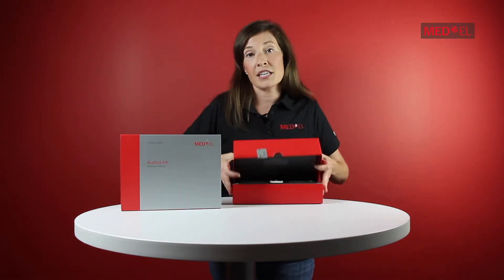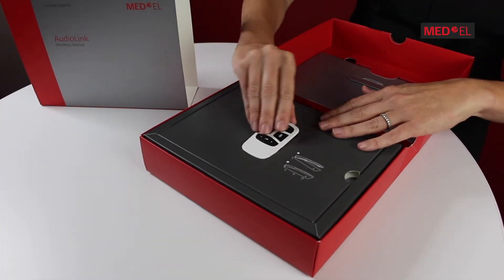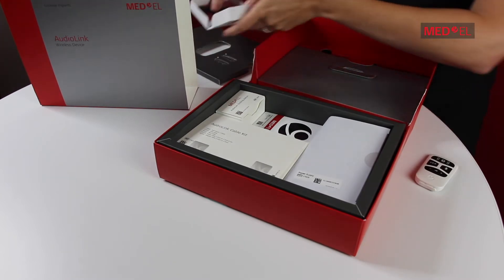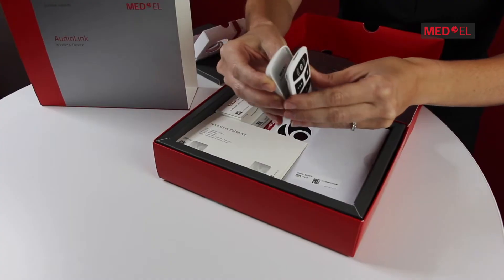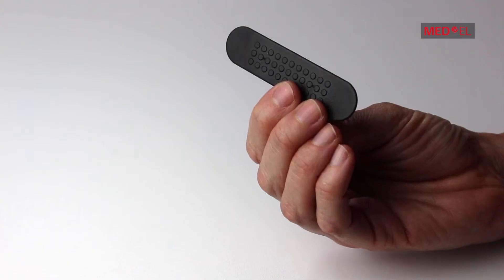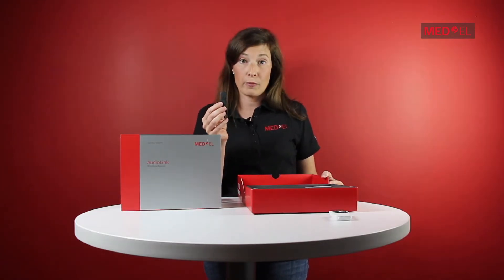When you open the box, the first thing you'll notice is the main unit. The first thing you'll need to do is attach the rechargeable battery, which is located directly below. Make sure to attach the battery at a 45-degree angle and snap it together like so. There's also another tool included with your rechargeable battery — we'll call this your changing tool. You shouldn't need it right away, but you'll want to hang on to it in the event that you ever need to change out your rechargeable battery.